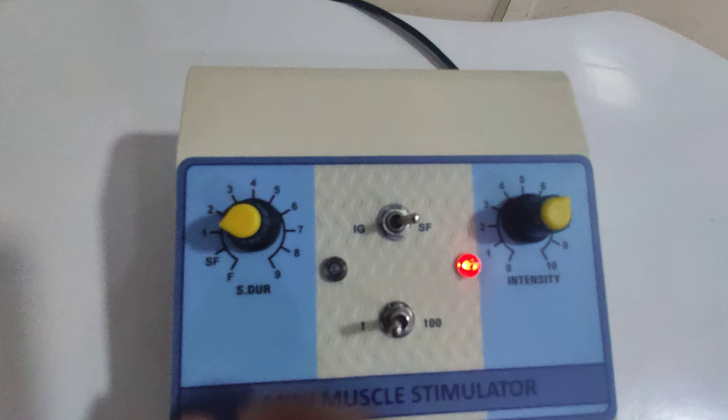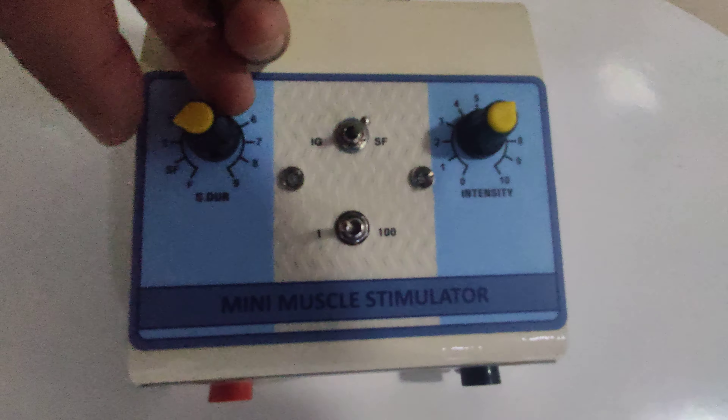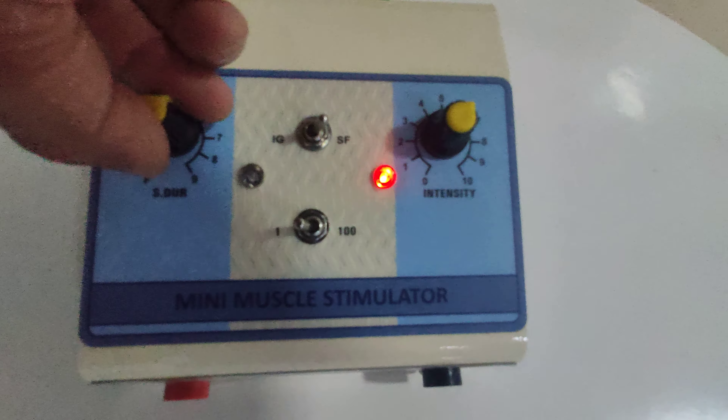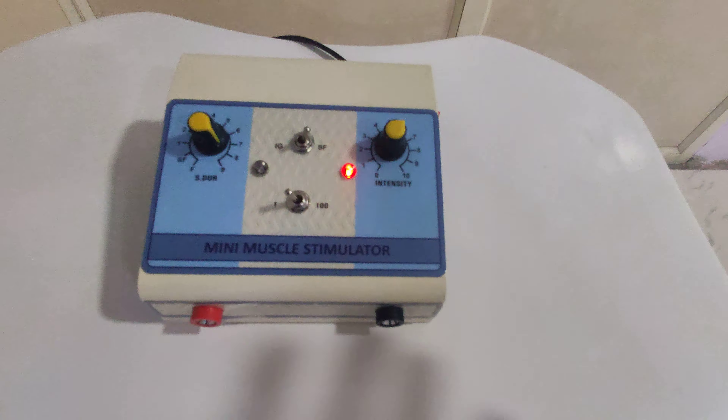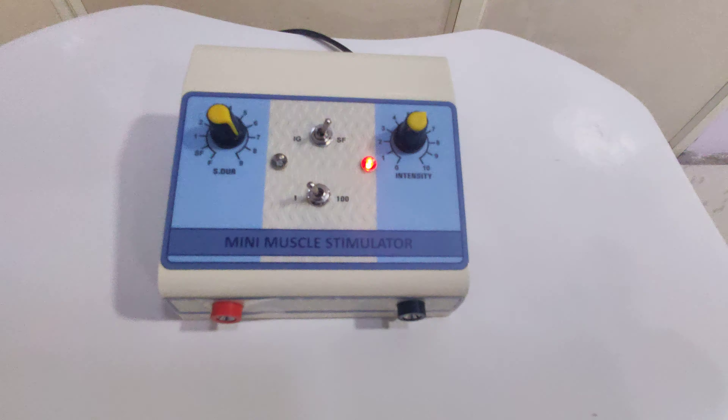When you increase the timer, the light will also blink accordingly. This is the way for operating this machine. Thank you so much for watching our video.